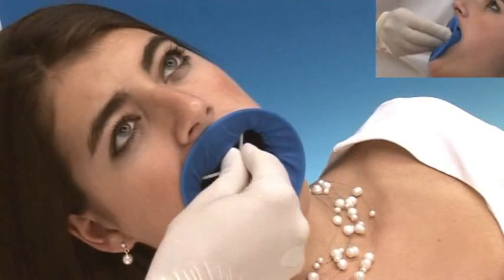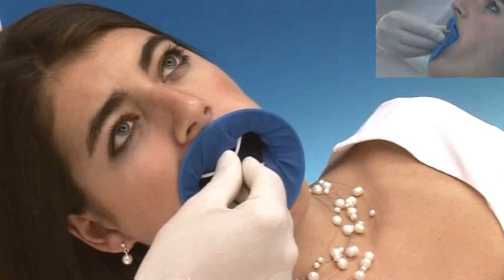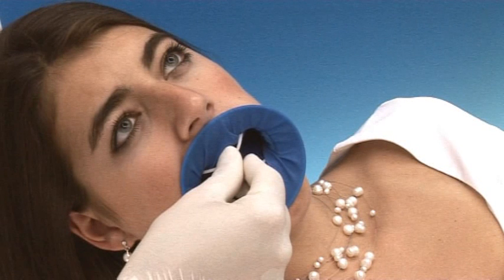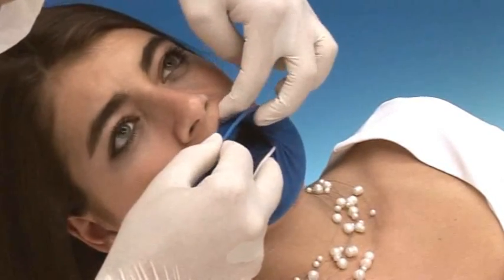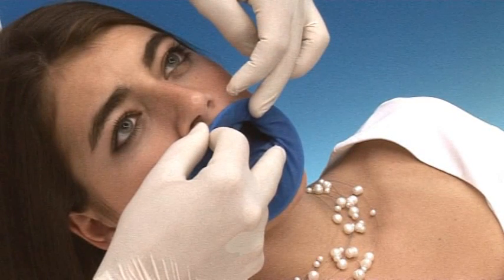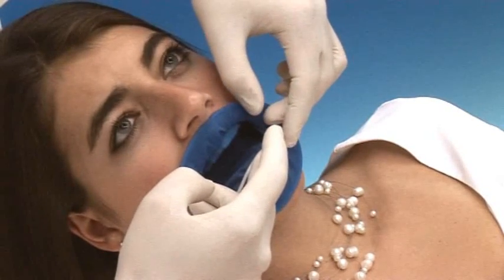Placing the second wing can be achieved with or without using a mirror as an aid. In the third step, the intraoral ring is placed in the fold behind the upper lip. To achieve this, bring the extraoral ring to the level of the vermilion border and ask the patient to slightly close his or her mouth. In most cases, the intraoral ring will then slip into the fold by itself.